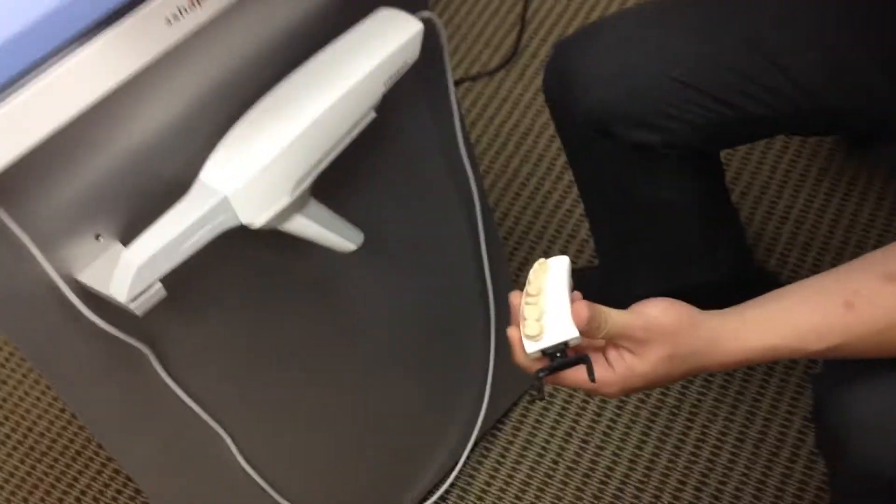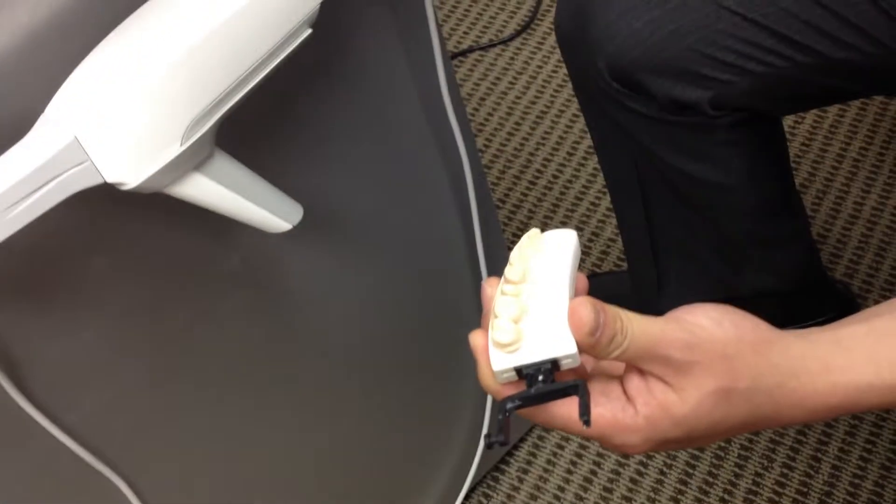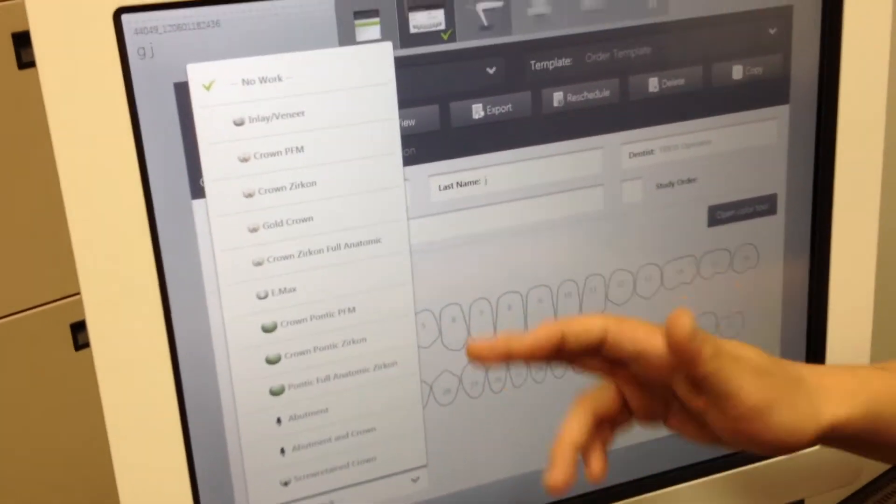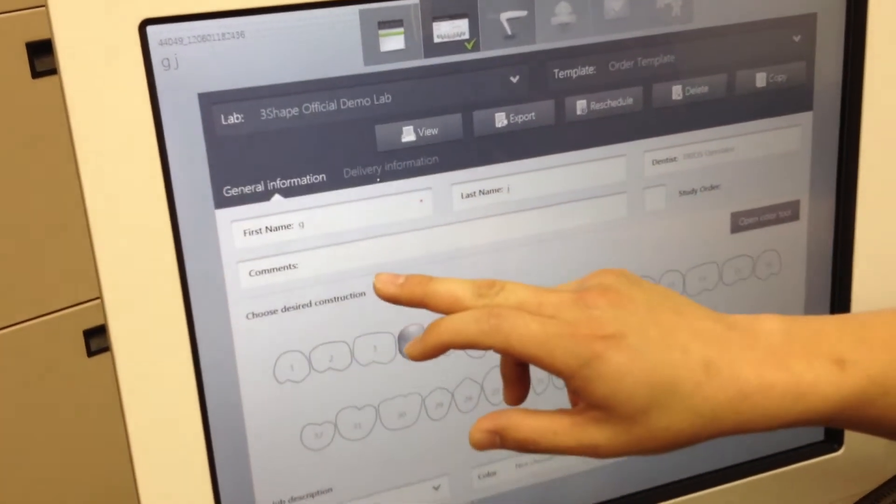So for this model itself, I have tooth number 4, so I'm just going to go ahead and choose my tooth number here. Under job description right down here, I'm going to choose the type of work I would like to do. In this case, I'll say that I want a zirconia crown, so I'm just going to go ahead and choose that.